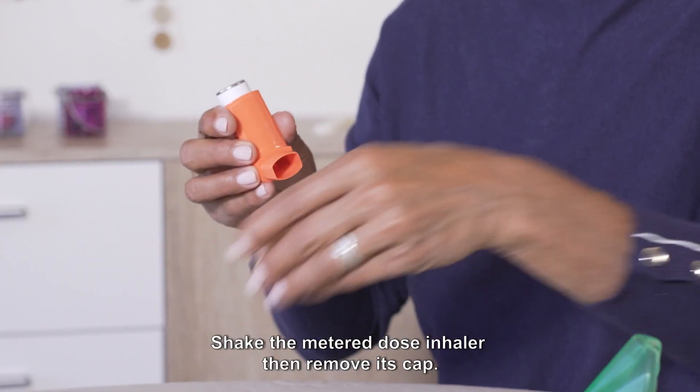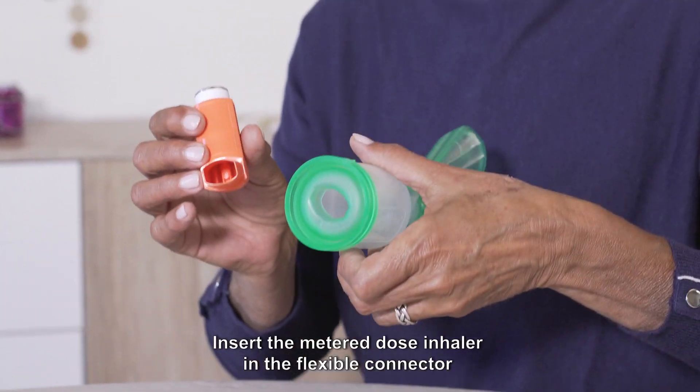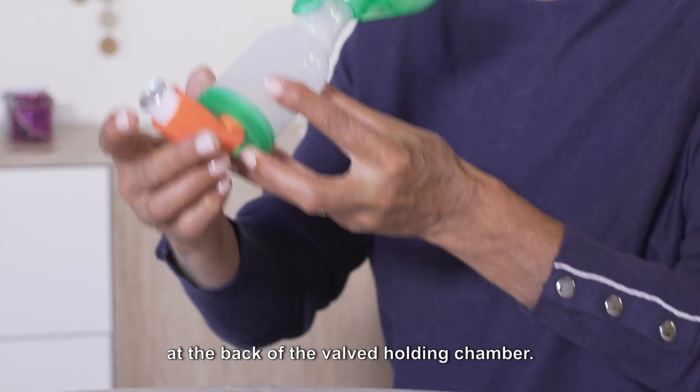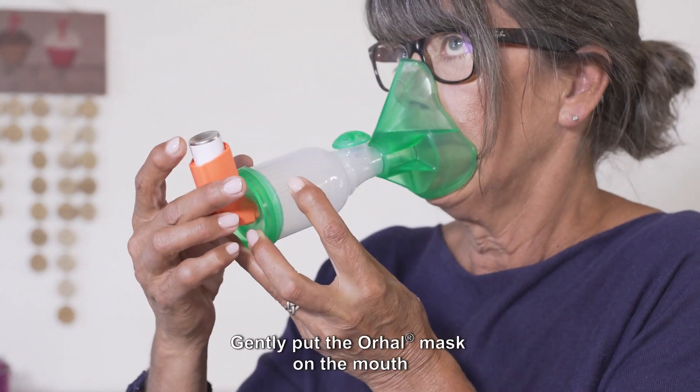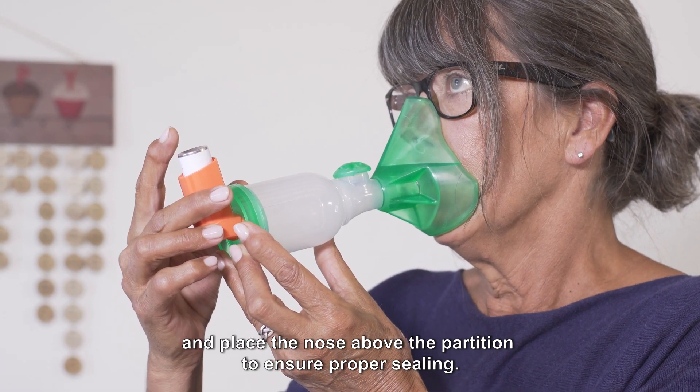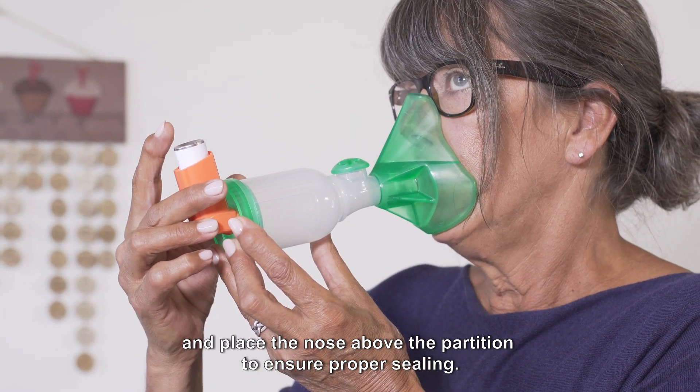Shake the metered dose inhaler, then remove its cap. Insert the metered dose inhaler in the flexible connector at the back of the valve holding chamber. Gently put the oral mask on the mouth and place the nose above the partition to ensure proper sealing.